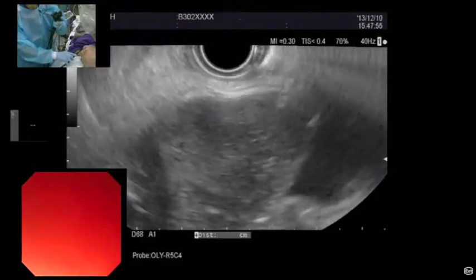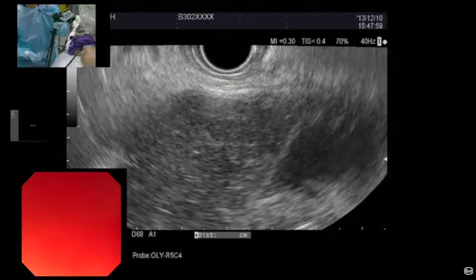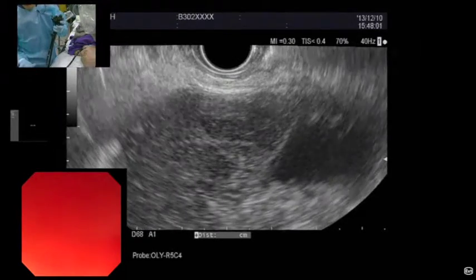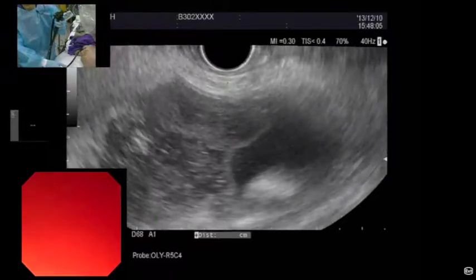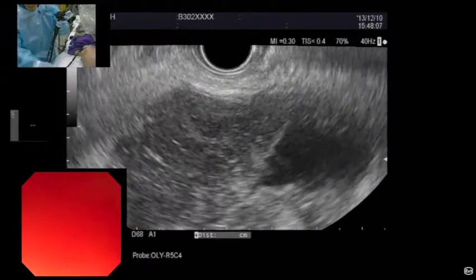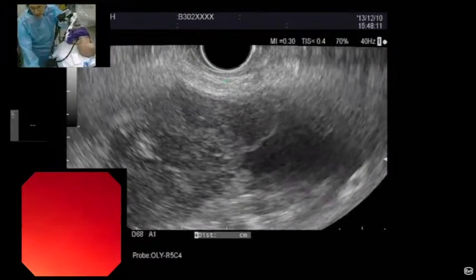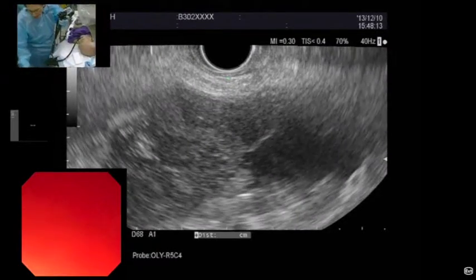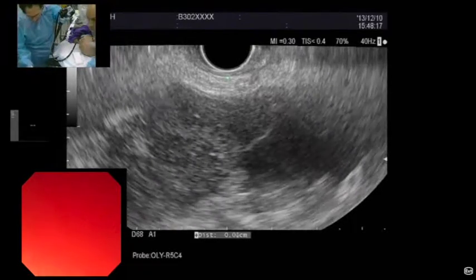But sometimes when the gallbladder is chronically inflamed, similar to a pseudocyst, it can become fused with the gastrointestinal wall, with the bowel wall. But here, not only do we see this echogenic layer, but we can also measure a distance. And Anthony's helping me out here with his system.